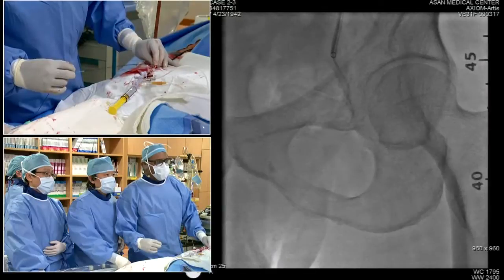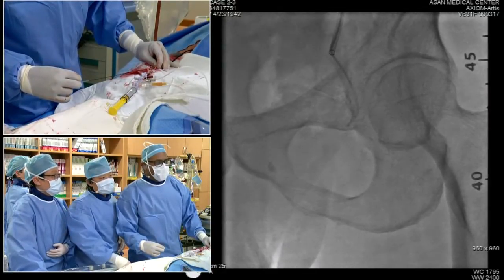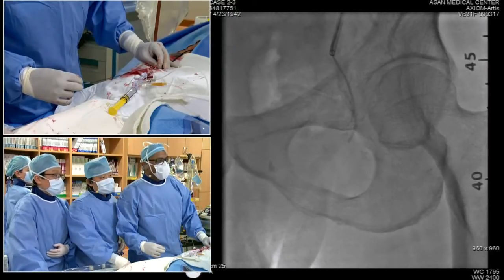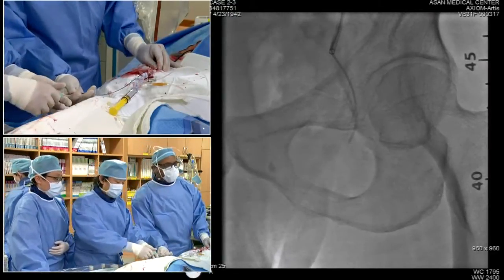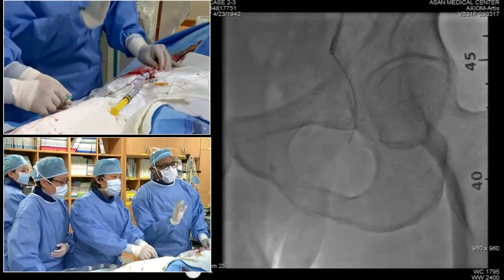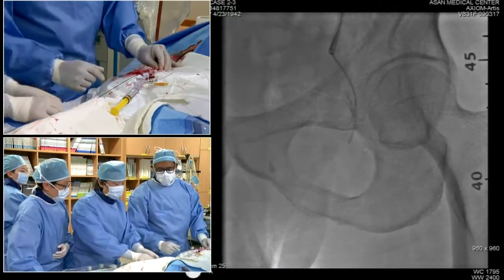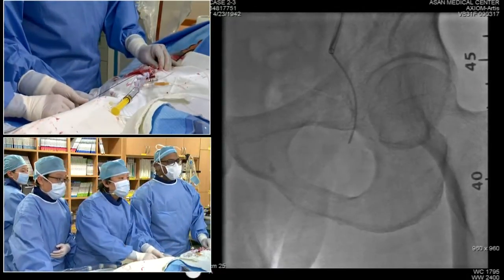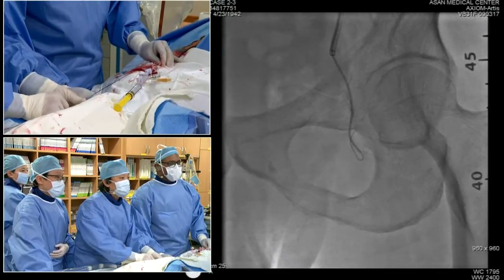What I'd like to do is, if you have a syringe, we're going to just take a picture here to make sure that we are where we should be, and I believe we are based on this. I'm going to hold some pressure here, and I want you to advance the wire. I'm actually buttressing the 4 French end-hole glide cath. Good, push, push, push. Go ahead, good.